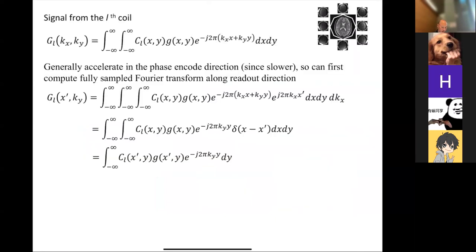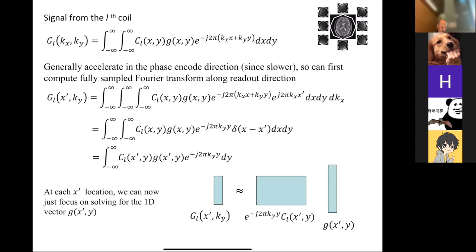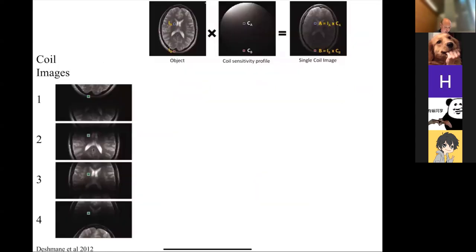Okay. So just skip over that. I'm going to walk you through this and give you a sense of how SENSE works. Then we'll show you that there is math behind it, but I really just want you to understand how SENSE works from a very simple point of view, what can go wrong with SENSE, and why we design the coils the way we design them.